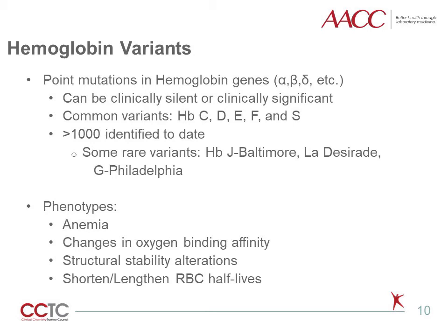Some recent literature suggests that there are in fact differences in the degrees of glycation of hemoglobin S, which could lead to confounding problems for assays that don't discriminate the glycated versions of hemoglobin A and variant hemoglobins. Of the more rare hemoglobin variants, there are currently over 1,000 that have been classified, often named by the city or region in which the initial case or family was identified.